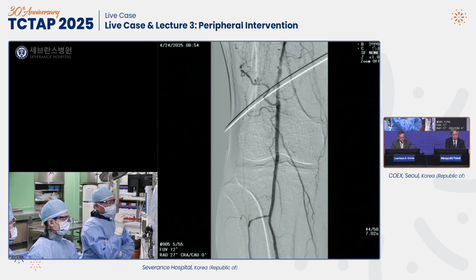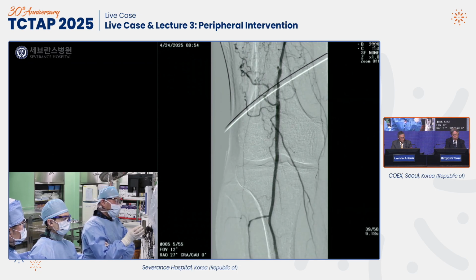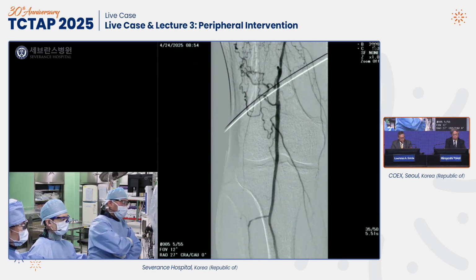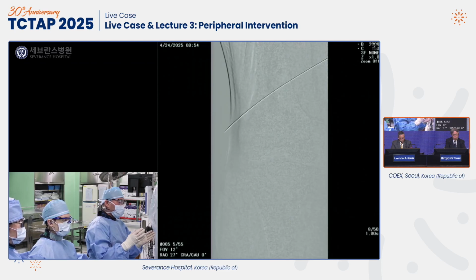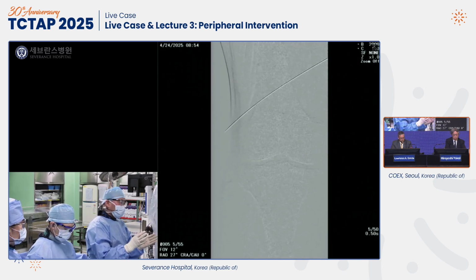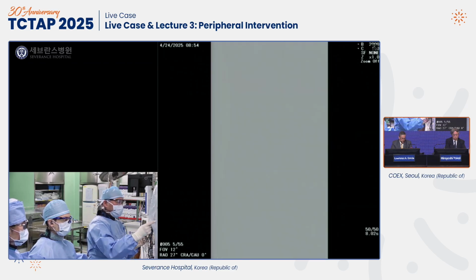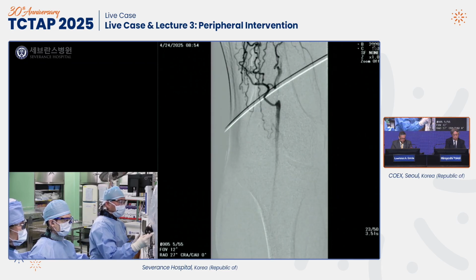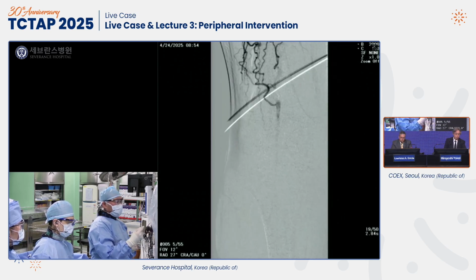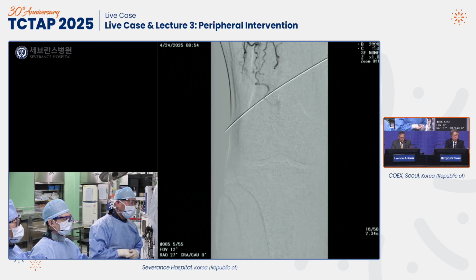Previously I preferred to have the pedal access at the level of the distal tibial arteries. But recently, I changed my strategy. It is easier to puncture the proximal ATA. As you can see on the angiogram, if you spread the space between tibia and fibula as wide as you can, then in that projection you can clearly see the anterior tibial artery. The anterior tibial artery originates from the popliteal artery behind the knee joint, then comes through the interosseous membrane and comes anteriorly. So you can puncture the anterior tibial artery easily, and also achieve hemostasis easily after the procedure, just by compressing.